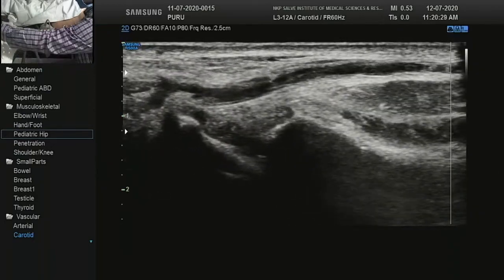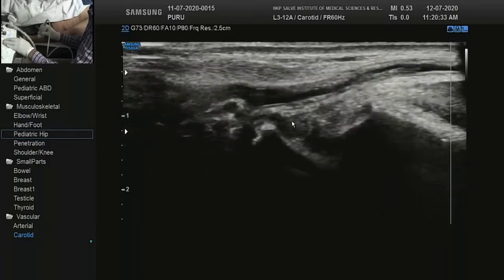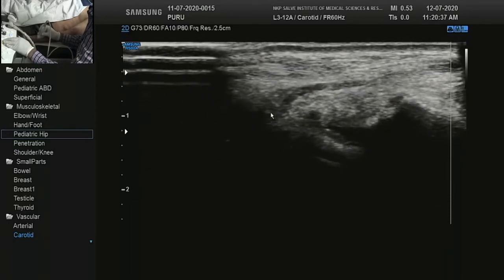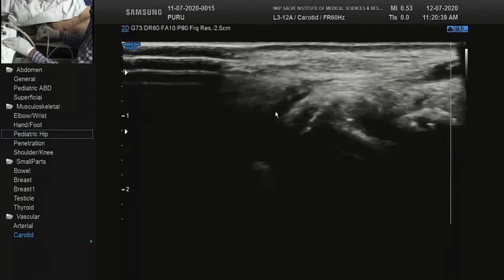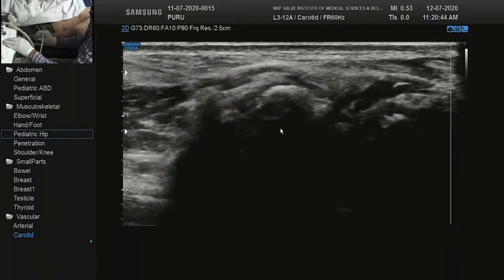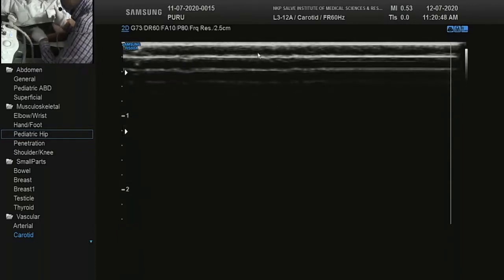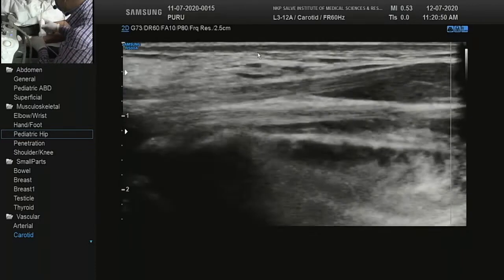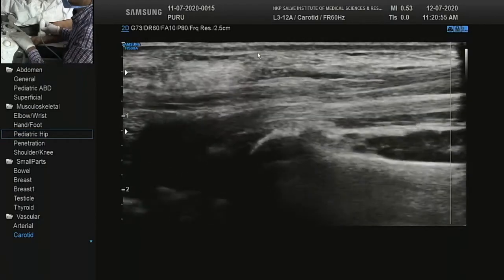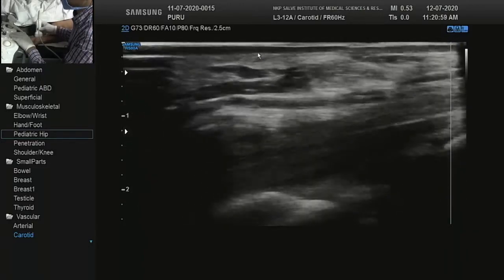This is the lower end of the radius, and immediately it branches a little laterally and to the dorsal side. It goes deep and then goes round and forms the deep palmar arch, whereas the ulnar artery will form preferentially the superficial palmar arch.